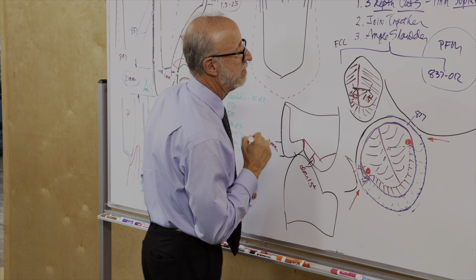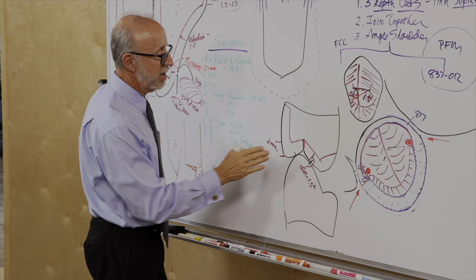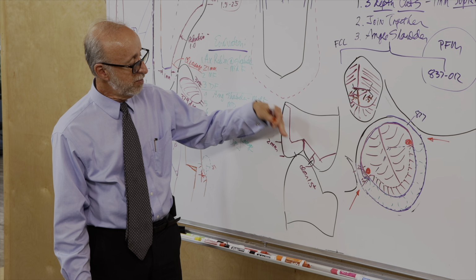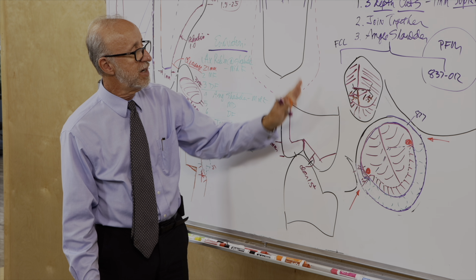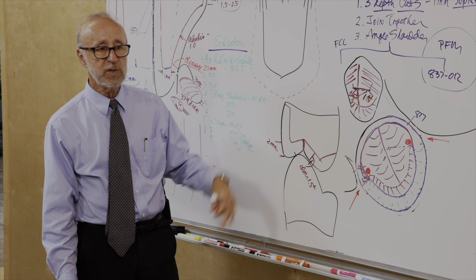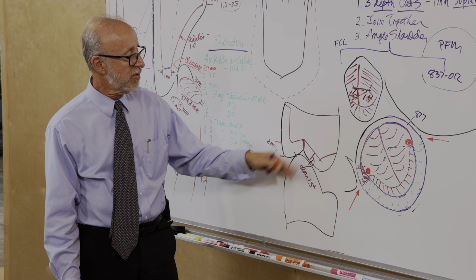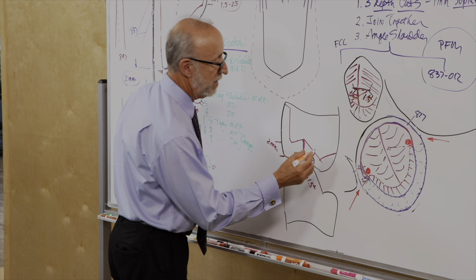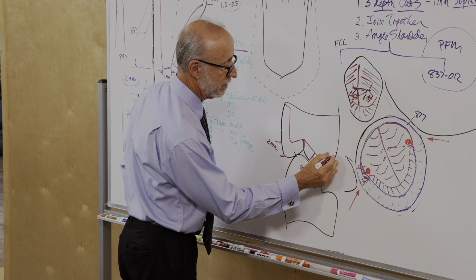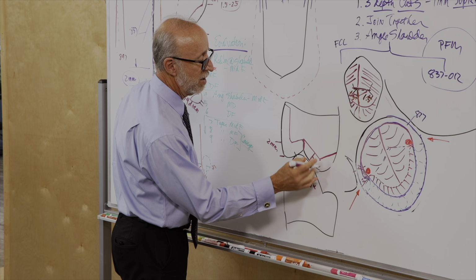So we want to make sure that we realize that plane does have a ridge, there are two planes, there is a ridge, move the ridge, get the same clearance on both sides. Again, more than we would normally use for gold, because we're using porcelain and metal over here. The C-plane, it's going to be angled like this.